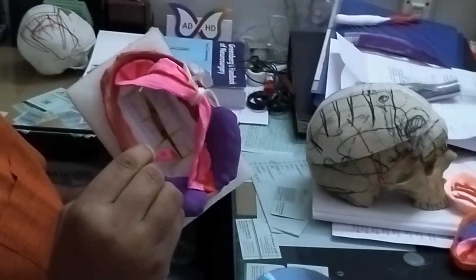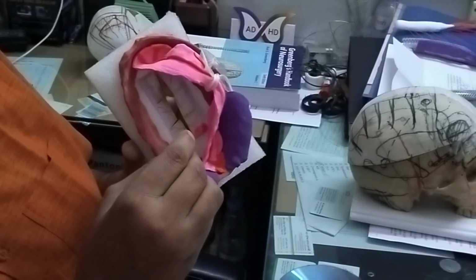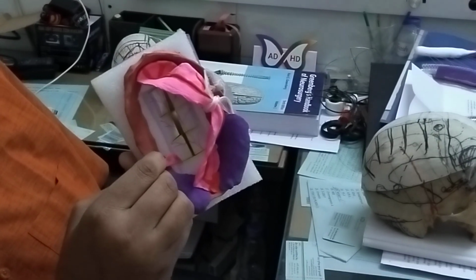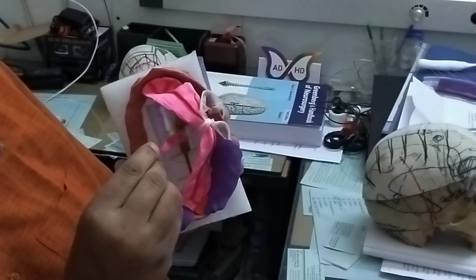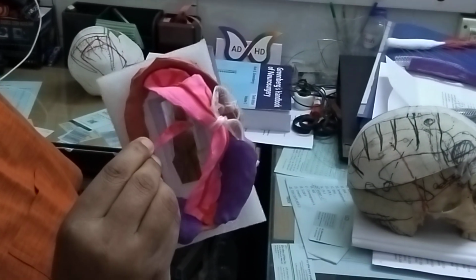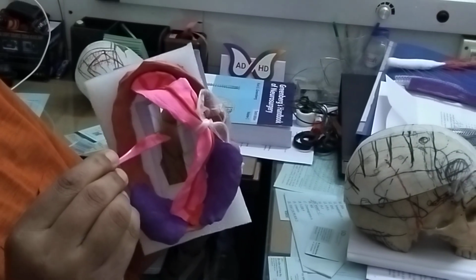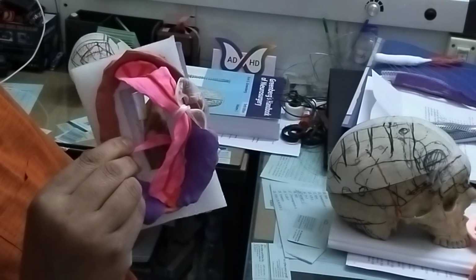So we have a design to open the dura initially by a vertical incision, then that incision is elongated at the upper and lower ends by two transverse incisions, and it looks like a capital I. After giving these transverse incisions, we divide it into 3 and 3 leaflets on both sides, and necessary coagulation is needed at the margin of the leaflets. Without coagulation, there is a risk of developing acute subdural hematoma.